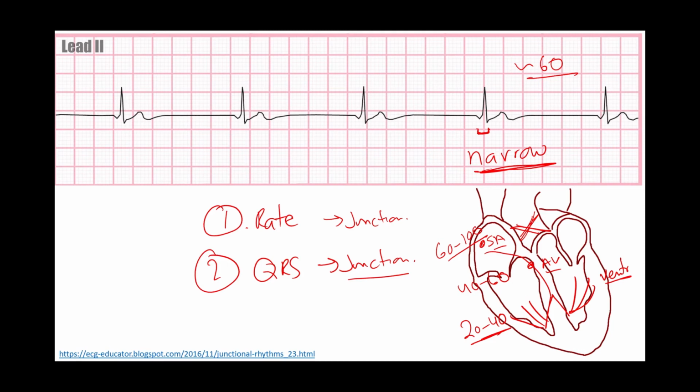When rhythms start in the SA or AV node, they go down the bundle of His and depolarize the left and right bundle branches at the same time, resulting in synchronized depolarization of the left and right ventricles. If the rhythm started in some point within the ventricle, then clearly one ventricle would depolarize before the other, resulting in depolarization occurring in a dysynchronized fashion. This would result in a wide complex.